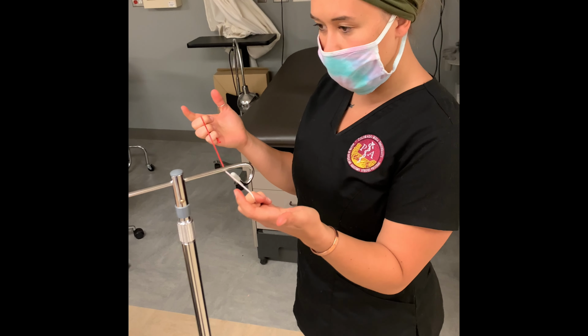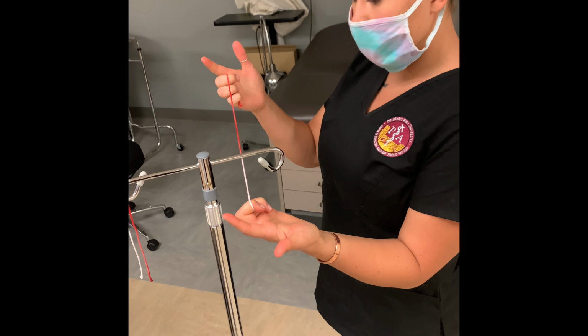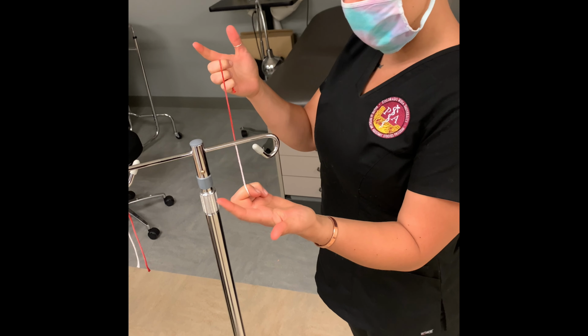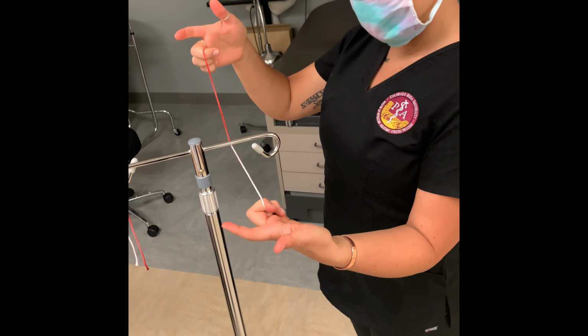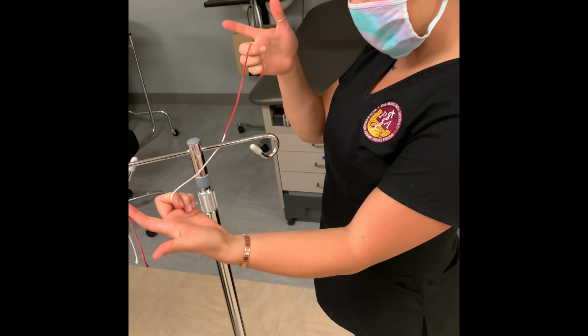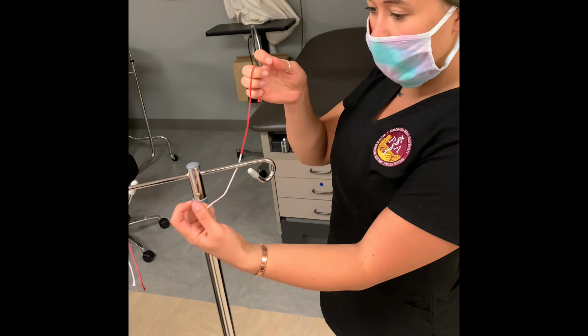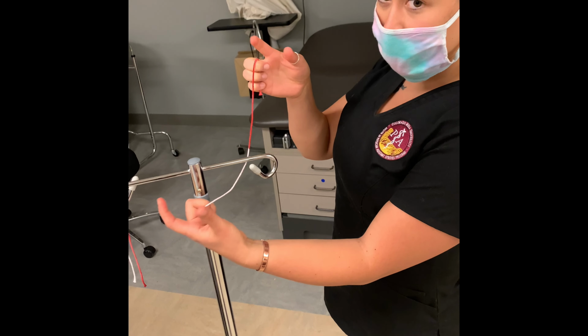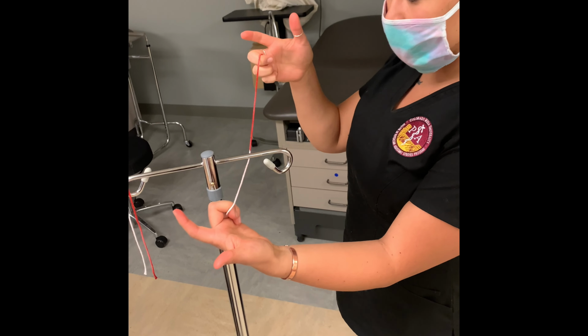So for the technique of double-handed knot tying, we're going to start by making square knots. You're going to place the center of your silk or nylon suture over the area of skin you will be making your knot. Take one end of the suture in each hand using the third, fourth, and fifth fingers. Thumb and index fingers should be free to maneuver and pinch. Make sure there are at least 6 inches of suture on each side to work with.